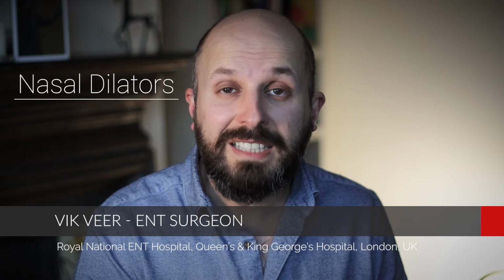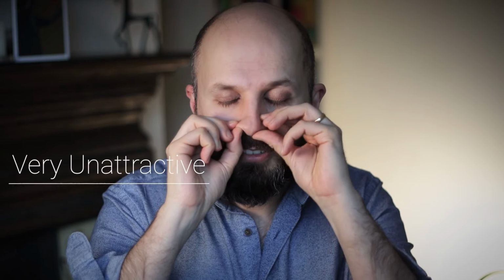Today I want to tell you about nasal dilators. Nasal dilators open up your nasal passages so you can breathe better. So it's a bit like doing this. You put your nose like this, it looks rather unattractive, but if you do this, you can breathe a little bit better. Another way to do it is do this. You can just breathe a little bit better.